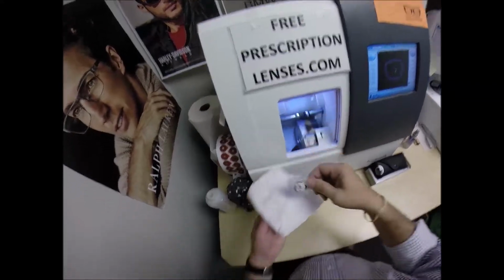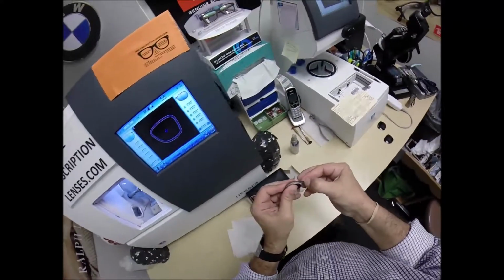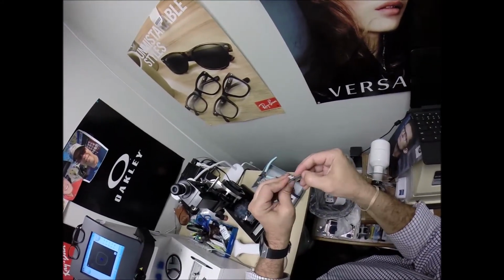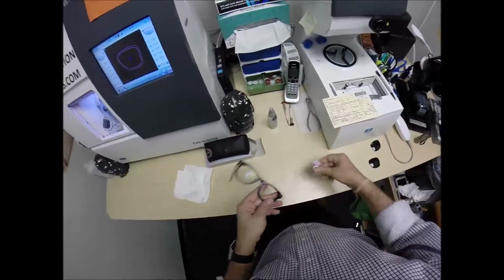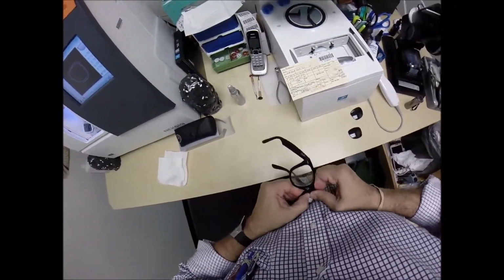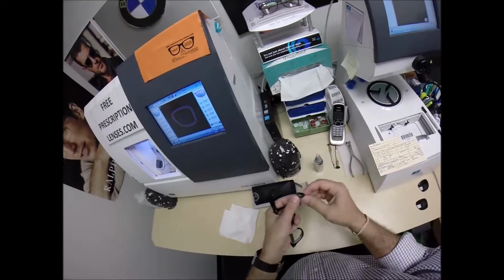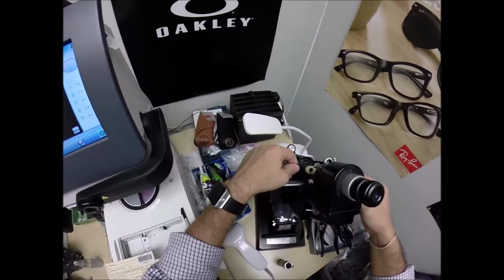So we're going to take the lens out of the chuck, the Charles, the Chucky baby, the Bambino. Run my thumbnail around to get, ooh, I love it when the sawdust comes off in one piece, just like lint out of the dryer trap. Get the rest of it off your lens. Where's your frame? I've already lost your frame. Come down here, we're going to tuck it in at the outside corners first. Push down at the nose, and it snaps right in. Take this block off, pull the sticker away, use my hand-approved drying method, throw that back in there. Add that to my sticker collection. We're going to come down here and put it in just above that black dot.